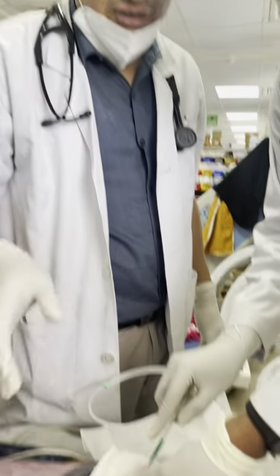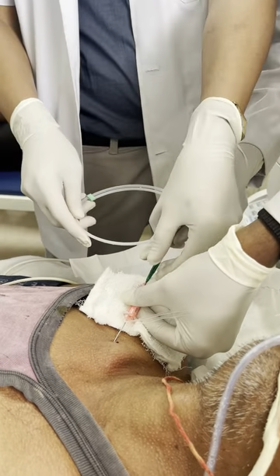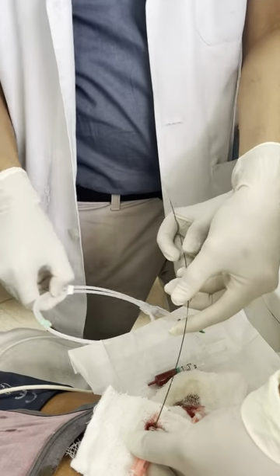See, this is a long line, so long. The guide wire is also long. So we will not insert it as a whole. We'll remove it like this. This much is enough.